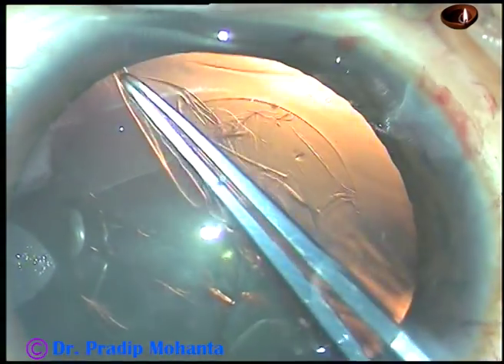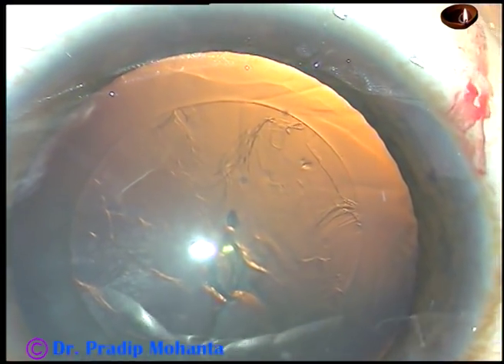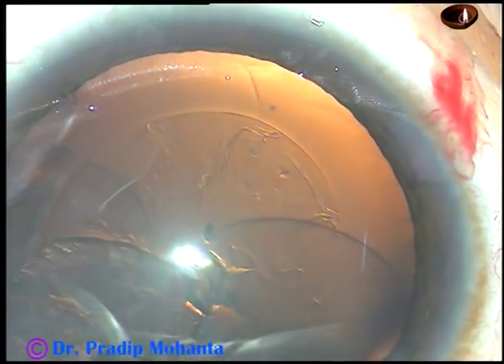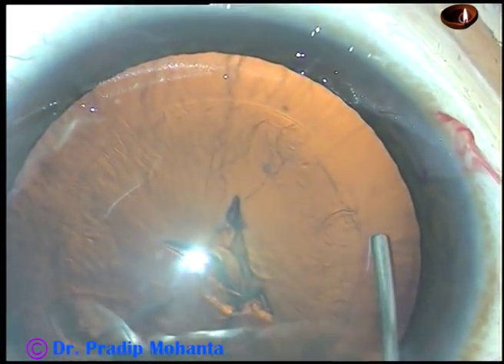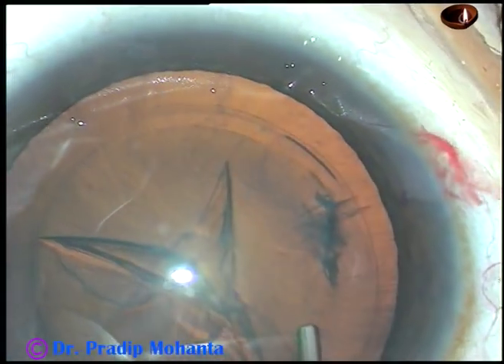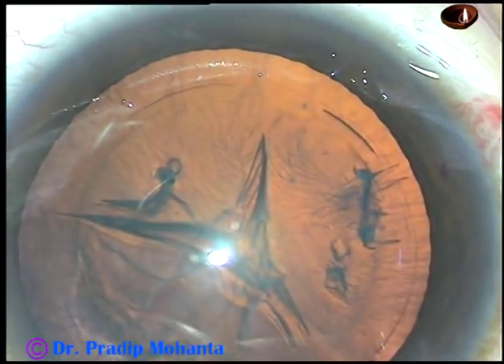If you develop this kind of control in your hand, you don't need any femtolaser. And now, hydrodissection. Fluid wave is passed from one side to the other side. Too much hydro is not required, and the nucleus need not be rotated.